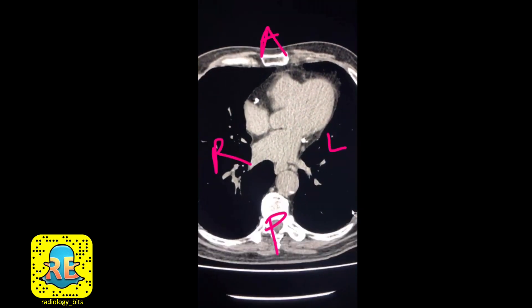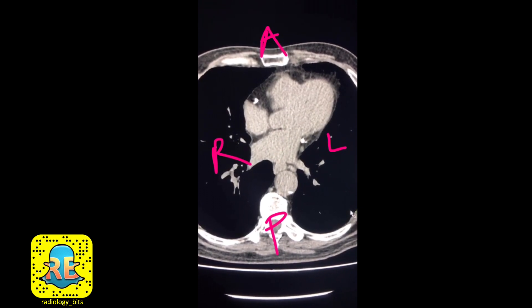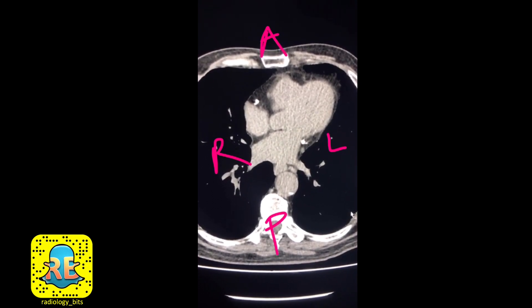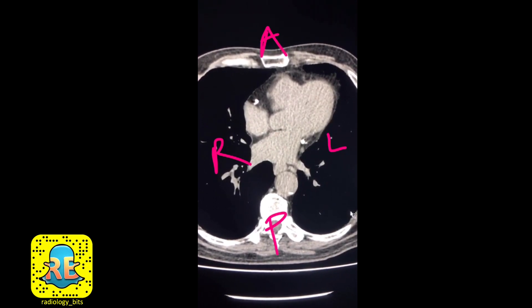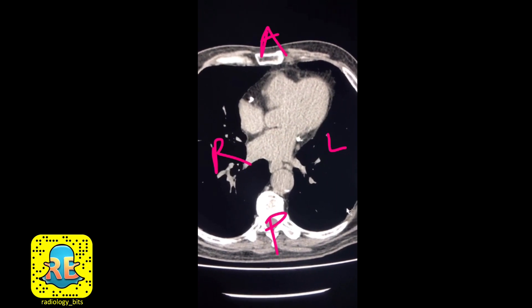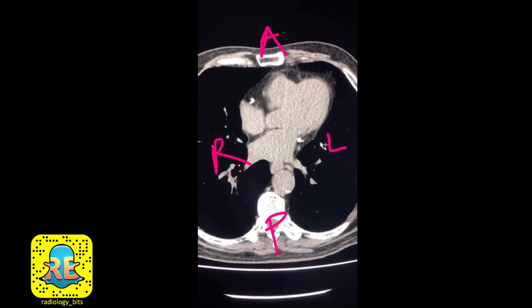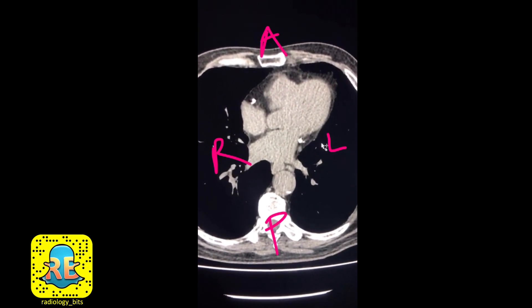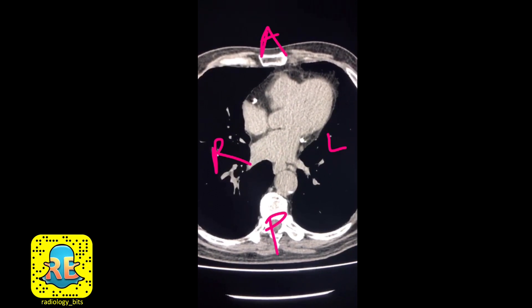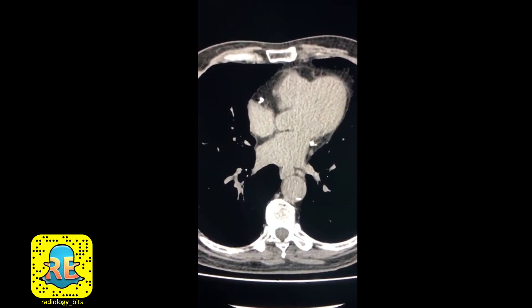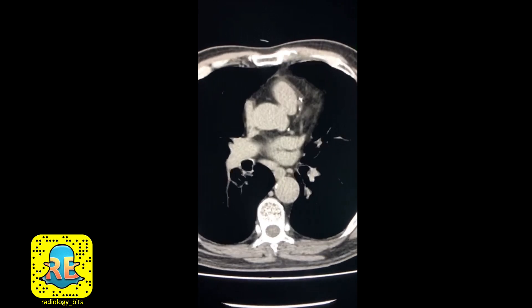To keep everybody oriented, this is a CT scan of the chest without intravenous contrast in a patient who's about 88 years old. What you're looking at is a patient lying on the CT scanner — you're looking from his feet. This is anterior, this is posterior, this is right and this is left. Now let's look at this together.